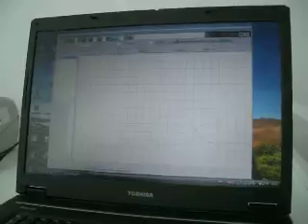This is the suprasystolic pressure step, from which step the pulse velocity, augmentation index, and central systolic blood pressures are calculated. So you can see here the very characteristic waveforms of the suprasystolic pressure level. Now that's how long a simple measurement takes. These are the set of parameters that can be obtained with the arteriograph unit, and I don't think that it is much more uncomfortable than a simple blood pressure measurement.